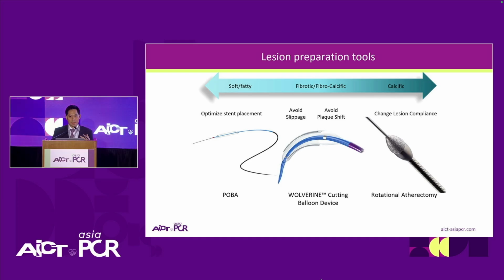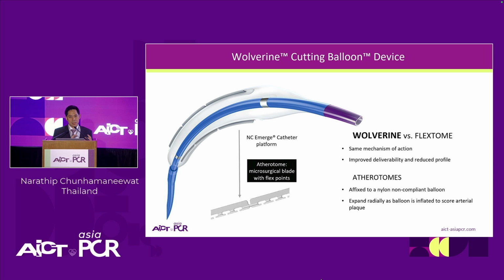So basically, I think now we have many tools to prep the lesion. It depends on what type of lesion it is: lipidic plaque, fibrous plaque, calcific plaque. And of course, cutting balloon is one of the tools that you should have in your toolbox. But let's talk about the design a little bit.